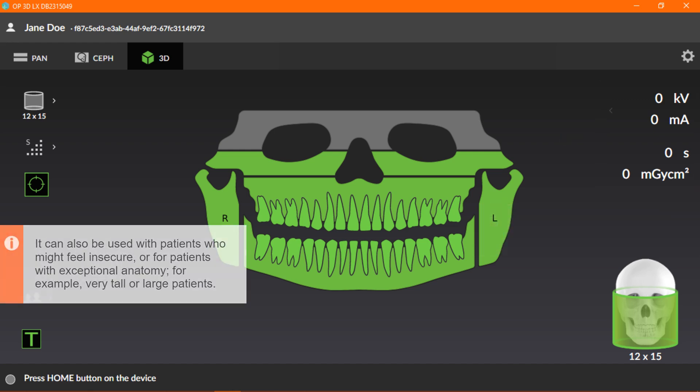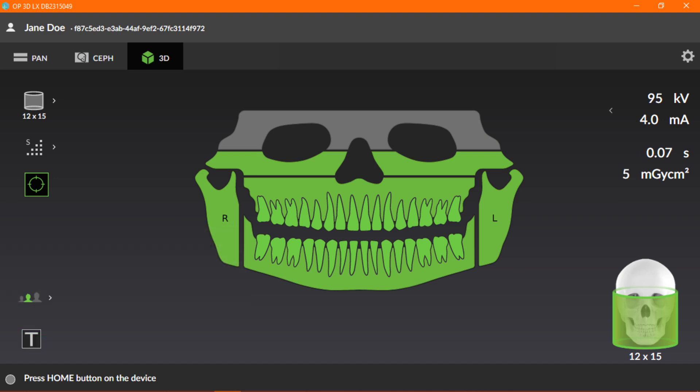It can also be used with patients who might feel insecure, or for patients with exceptional anatomy, for example, very tall or large patients. Finally, let's look at the status message bar, which is divided into two sections.